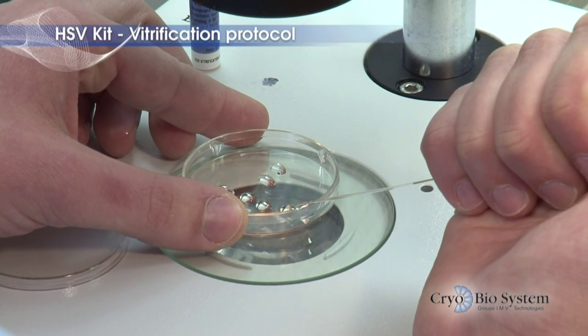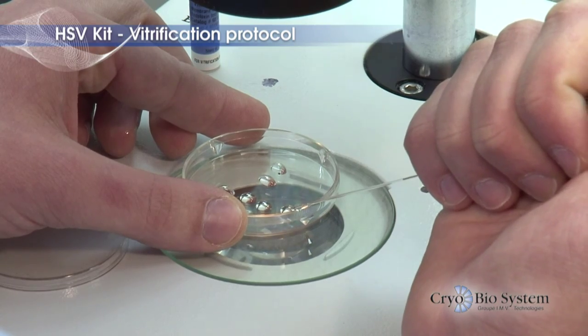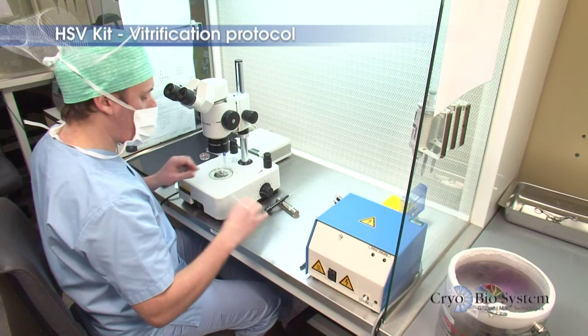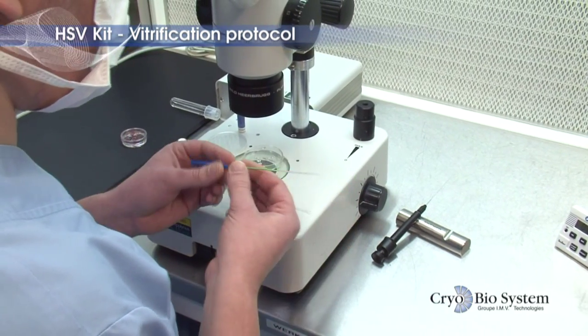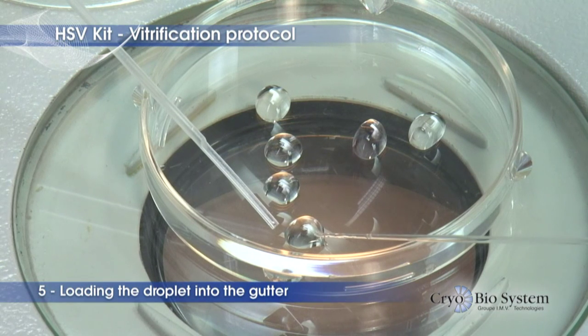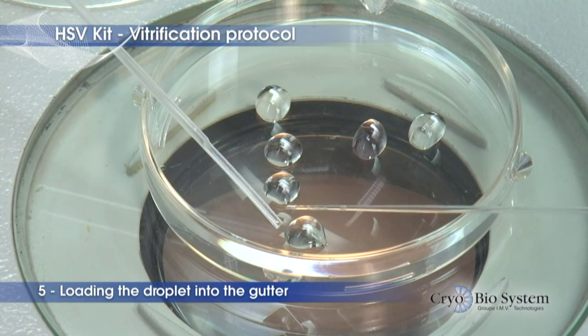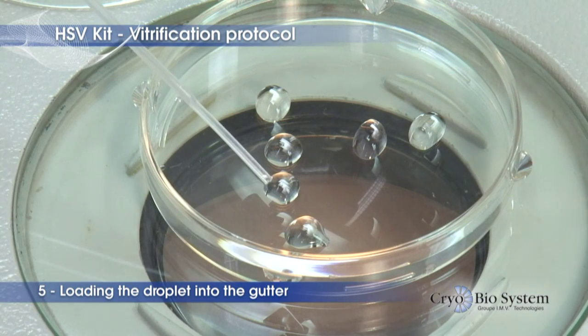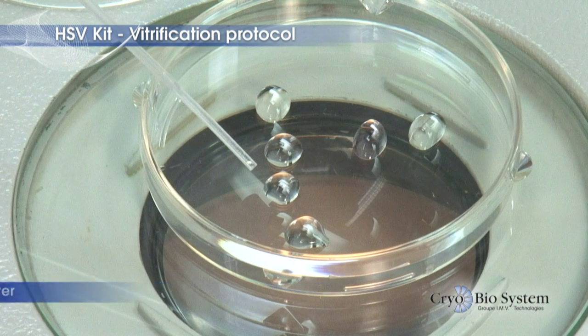When the sample is ready to be vitrified, take the handling rod and connected capillary in one hand. Then bring the extremity of the gutter close to the drop of media containing the embryo or oocyte. Using a micropipette with the other hand, carefully take and deposit the microdrop at about 1 mm from the end of the capillary gutter.